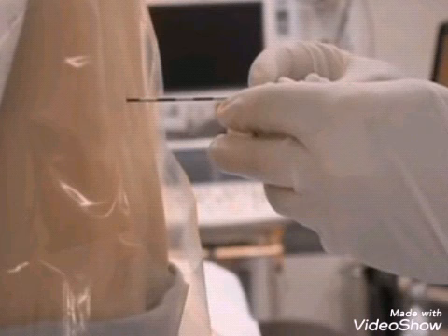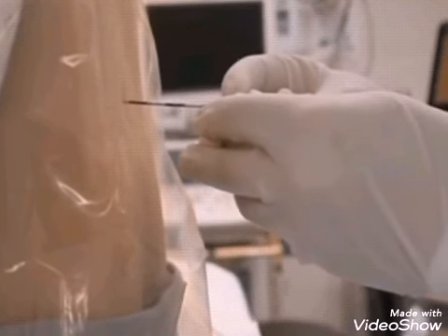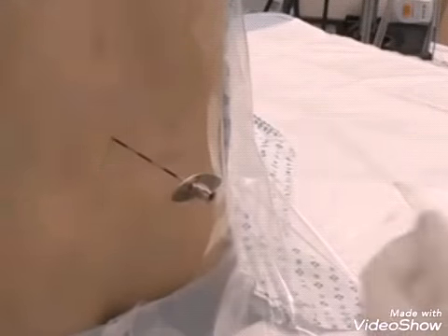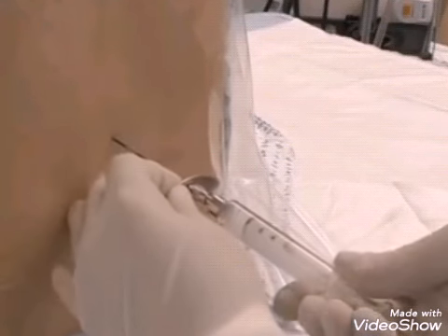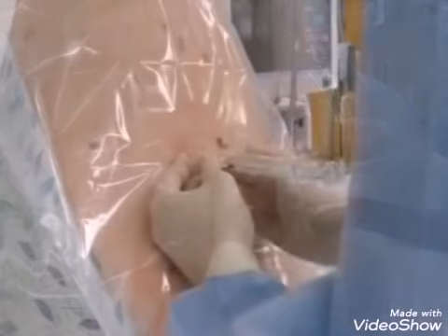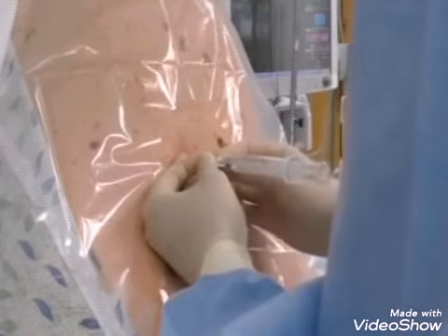Advance the needle to pass through the supraspinous ligament and into the interspinous ligament, which in most patients is at a depth of approximately 2 to 4 centimeters. Next, remove the stylet from the epidural needle and attach the loss of resistance syringe, which should contain no more than 2 to 3 milliliters of either air or saline. Before you advance the epidural needle further, make sure that resistance is present by gently tapping the plunger of the syringe. The plunger should not advance.